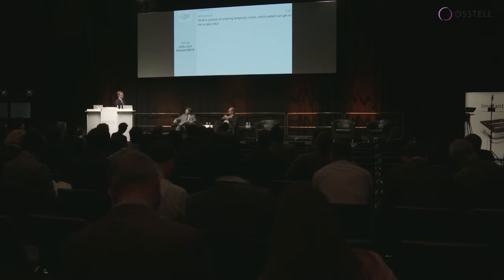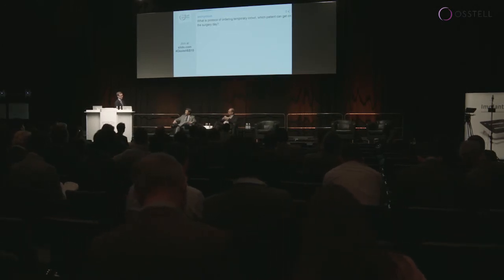Because with guided surgery, you control the positioning, the apical crestal level of the implant, the tilt, the buccal-lingual or buccal-palatal tilt, and so you can fabricate a very nice provisional in the lab and deliver it immediately.